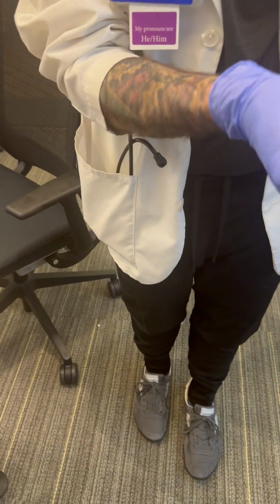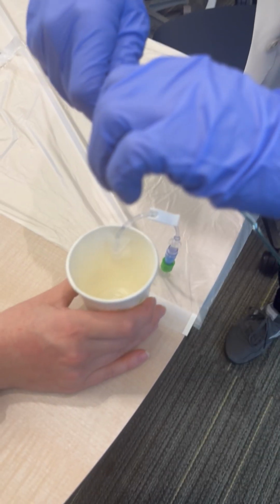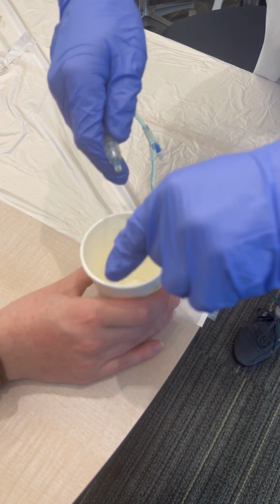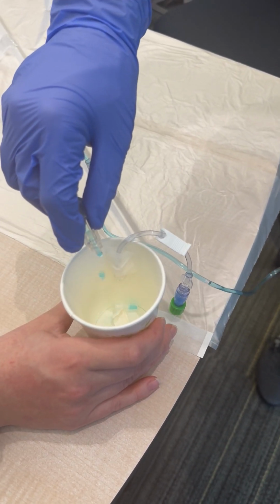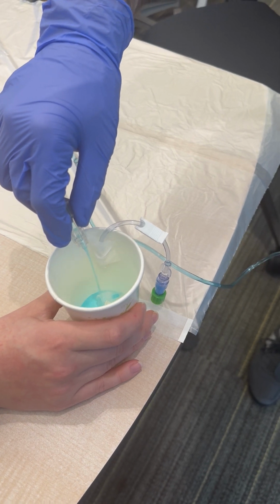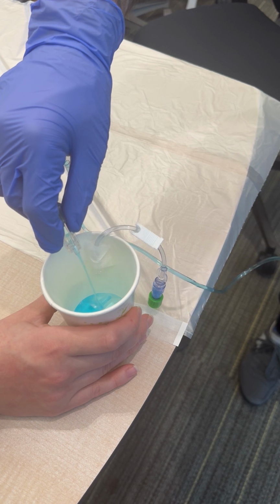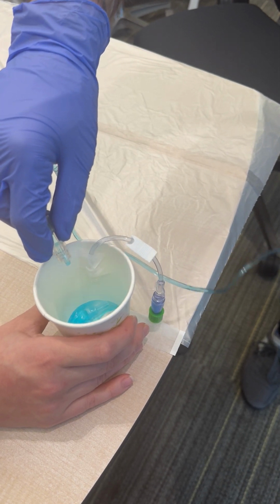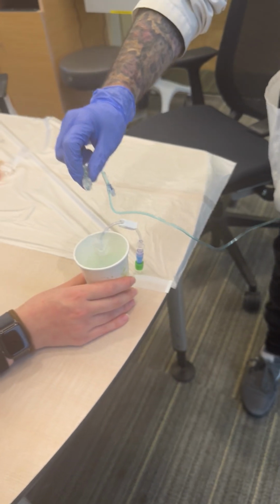Okay, now I'm gonna rip that, bring this over here. And with these, they don't twist off, you just kind of snap them. And then I'll just prime out the bubbles that are in the line. Really quick. Okay, we're good. Oh, just like a little more. Yeah, that's good there. So don't do what I just did.